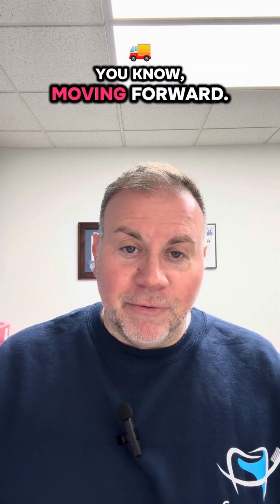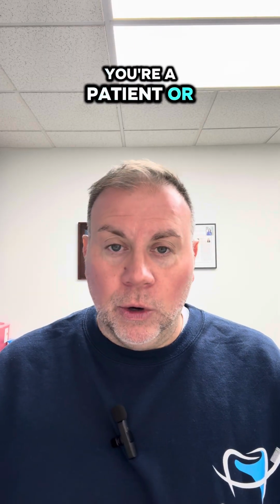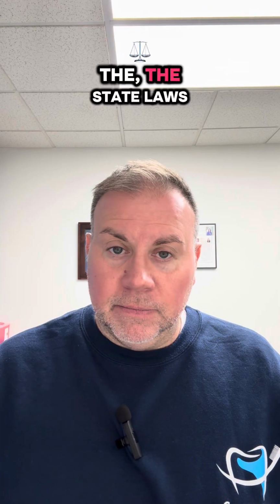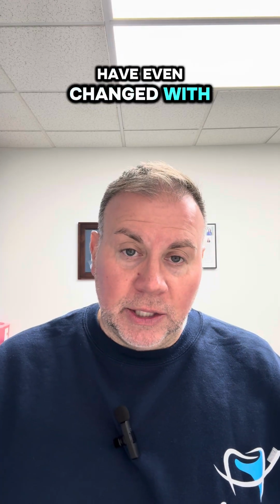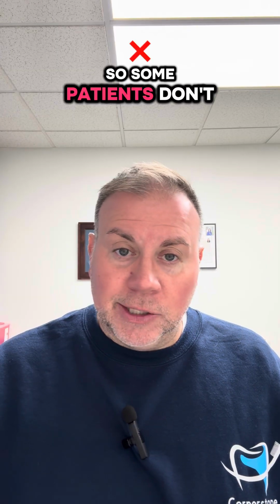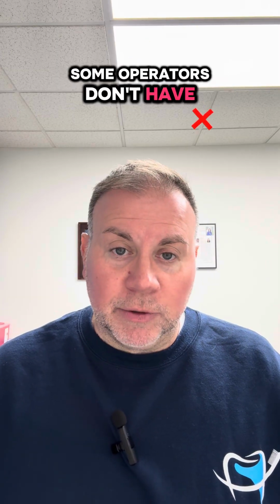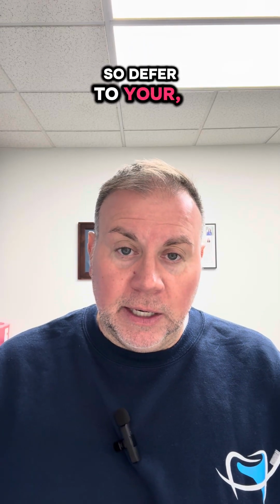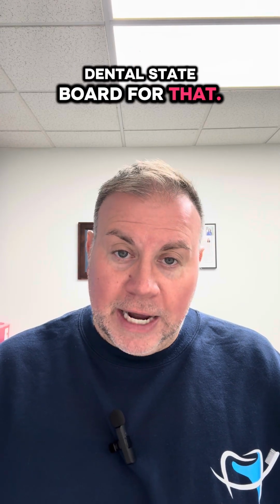And moving forward, like I said, whether you're a patient or you're a dental professional, keep in mind the state laws have even changed with lead aprons. So some patients don't have to wear lead aprons, some operators don't have to wear lead aprons. Please defer. That is state dependent, so defer to your dental state board for that.